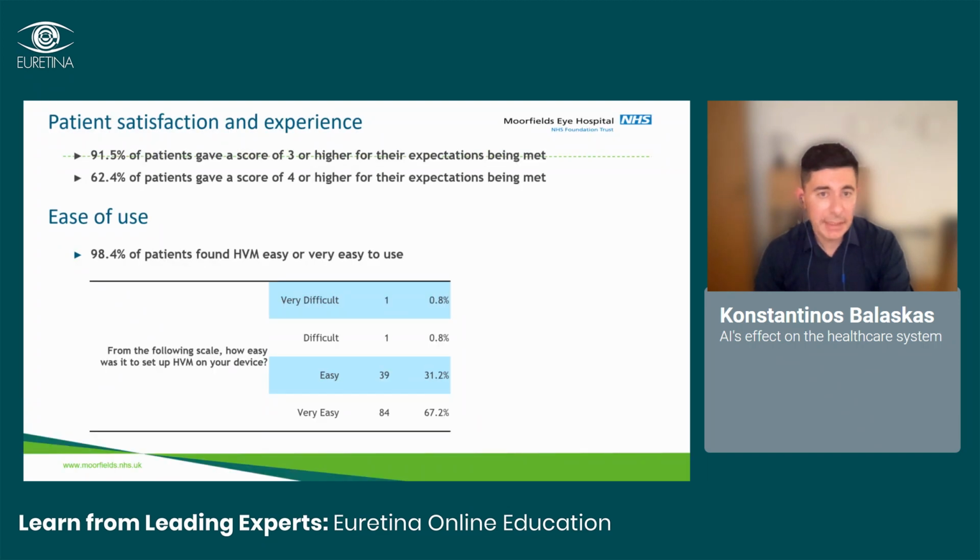We found extremely high levels of satisfaction and extremely high levels of reported ease of use with this technology. But there is probably some bias there because we are basing it on the patients who were able to use this technology and not the ones that were not.